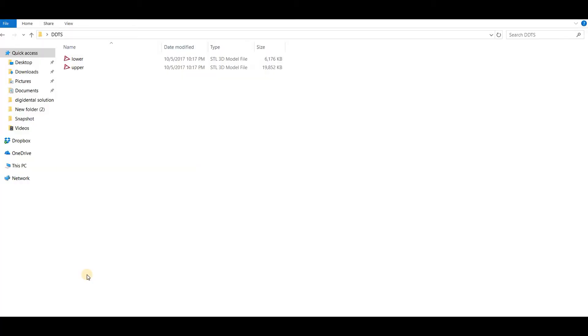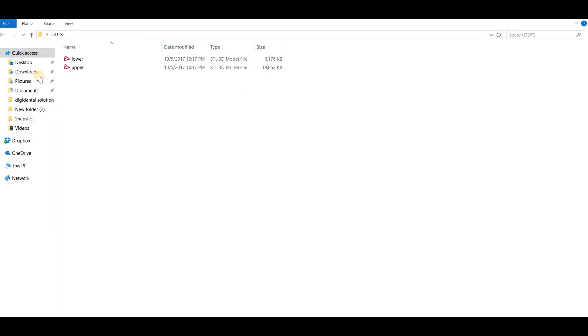Welcome to Digital Technology Solution. In this video I will show you how you can convert STL files into DCM quickly with a very simple method. We have two STL files. Now I will show you a very simple way to convert them into DCM.